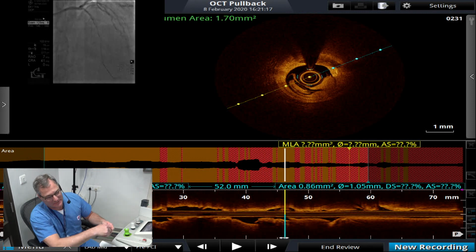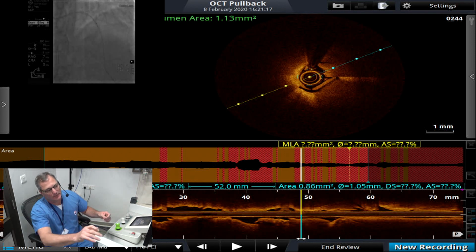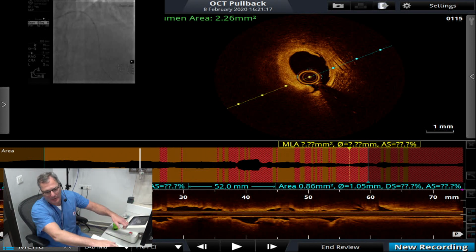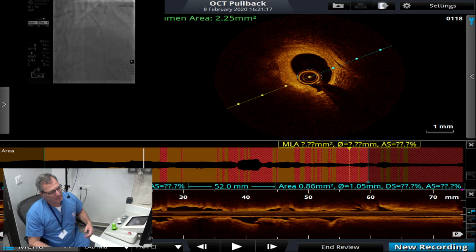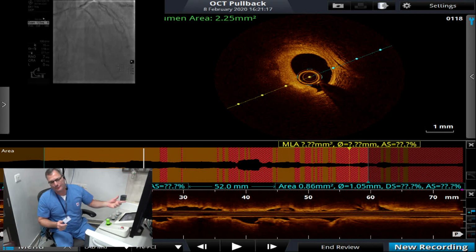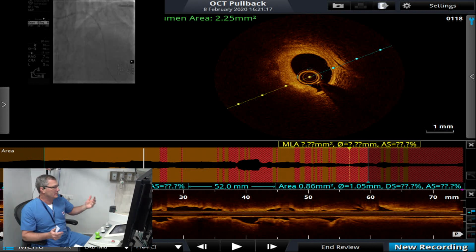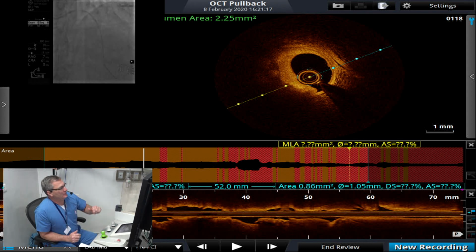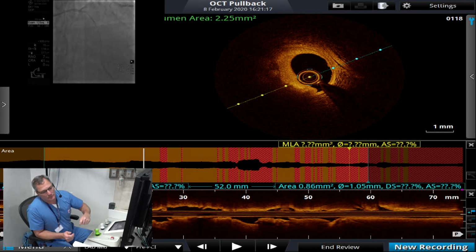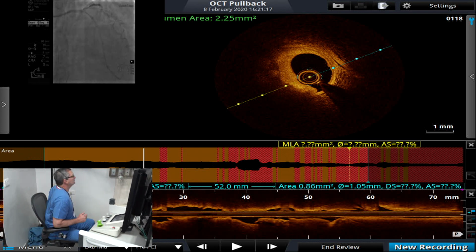It's basically disconnecting the connector to the sheath, the guide track, and then you park the robot clear over on the left radial position, and then take a microcatheter down, exchange your workhorse wire for the RotaWire, do your 1.5 or 1.75 atherectomy, and then put your microcatheter back down, put your workhorse wire back down, and reattach the robot.